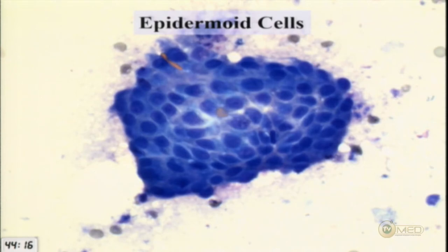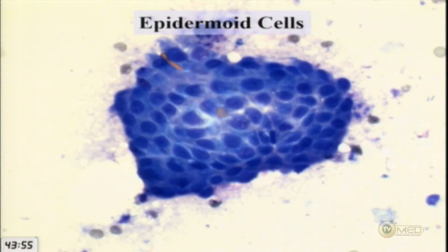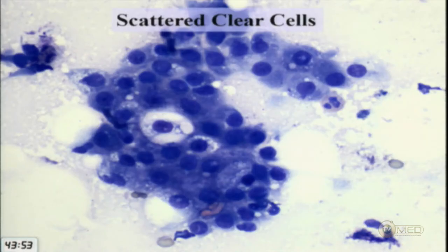Other groups of cells have an epidermoid look — they appear squamoid with well-defined cell borders, very cohesive, forming an almost flat sheet. This is a little concerning, and I use the term epidermoid because we started to wonder: could this be mucoepidermoid carcinoma?